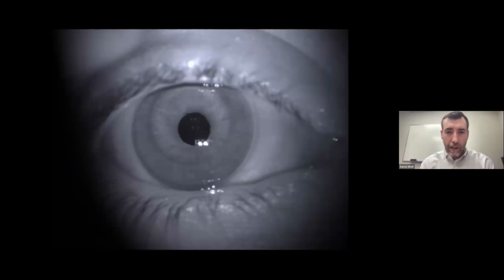What you want to see on a translimbal orthokeratology fit is you want it to essentially look like a soft contact lens. You want the lens to move subtly with eye movement or with blink. If they look up and they blink their eyes, it's very much just like a soft contact lens, maybe half a millimeter to a millimeter of movement. But you'll get less movement than what you will typically see with many of the corneal OrthoK designs.